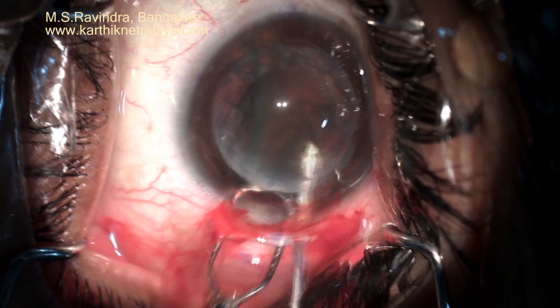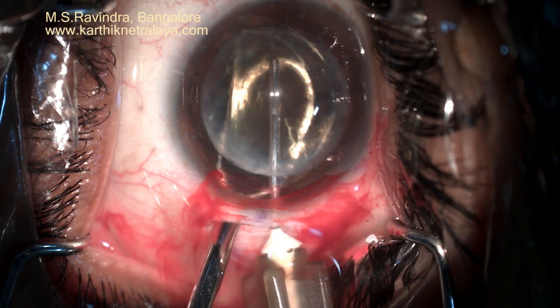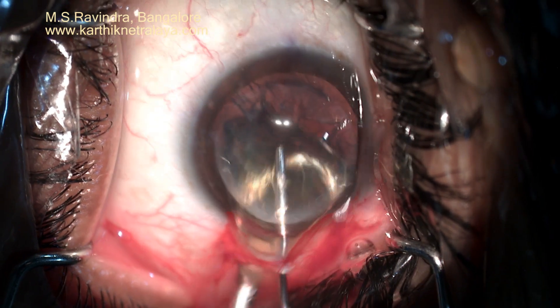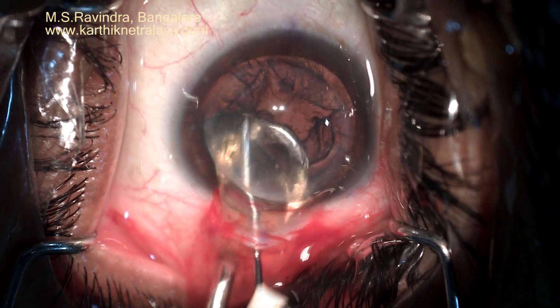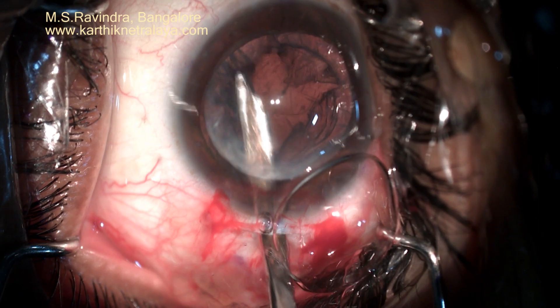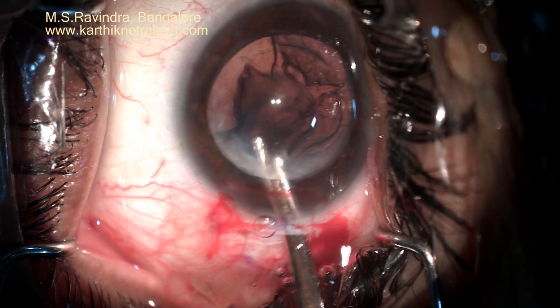Viscoelastic is being continuously injected and infused into the anterior chamber in front of the nucleus. You can see there is no touch to the endothelium at all during this procedure. The nucleus was soft, so it was easy to remove.